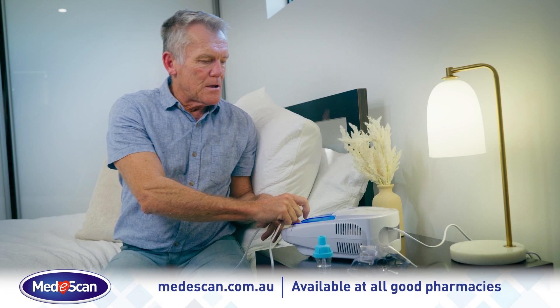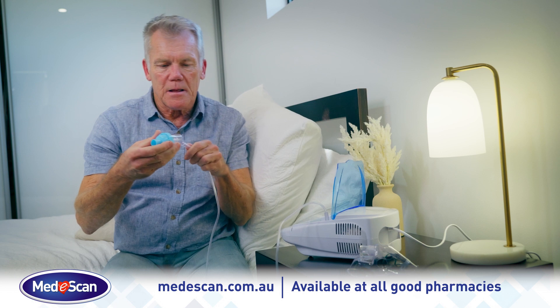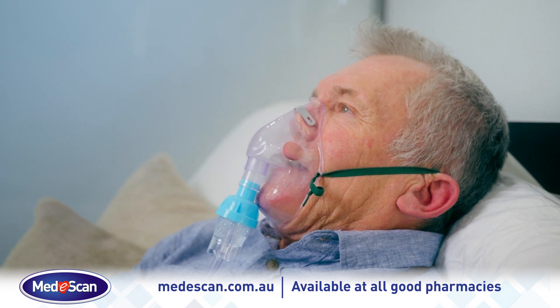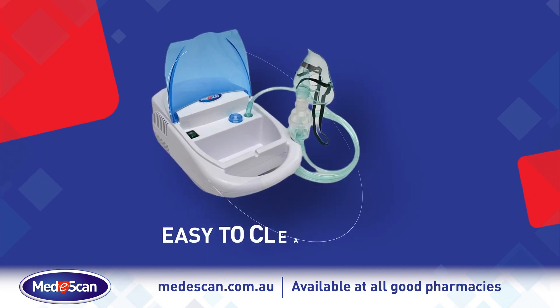To use the nebuliser, simply place it on a flat and stable surface where you can reach the controls while seated. For better nebulisation, we recommend breathing slowly and deeply, holding your breath for a few seconds and then breathing out slowly and completely.